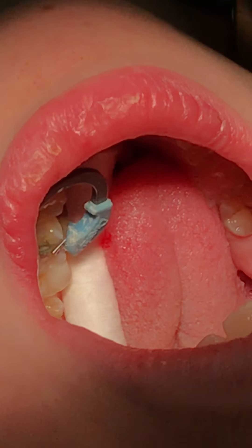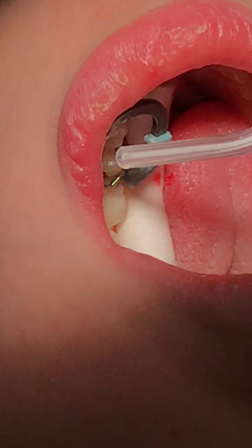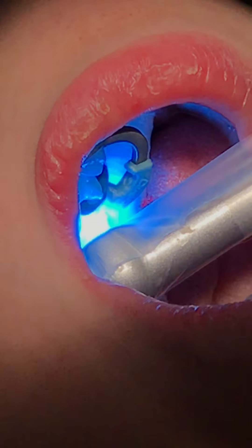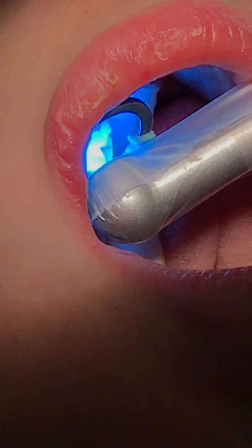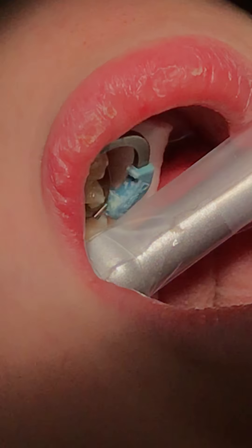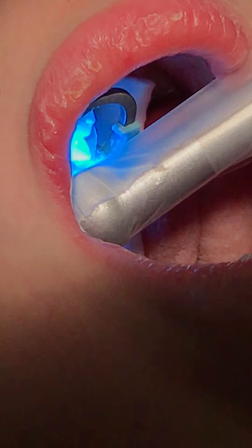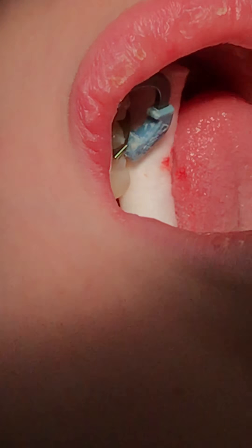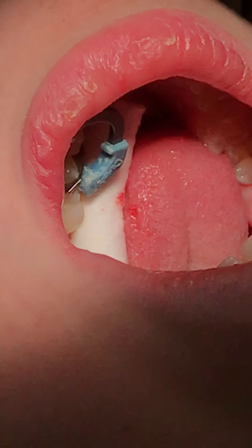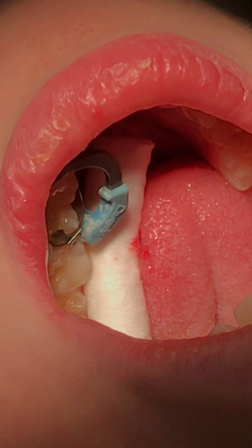The glass ionomer will give it a little bit more insulation and help protect the pulp because it's kind of deep. Go ahead and cure that. I'm going to thin out the adhesion — the Peak — because we don't want a pool of that stuff, we just want a real thin layer. Make sure it's nice and cured instead of just proceeding with the composite. The first thing I want to do is at least check that we have polymerization of this material — that looks good.